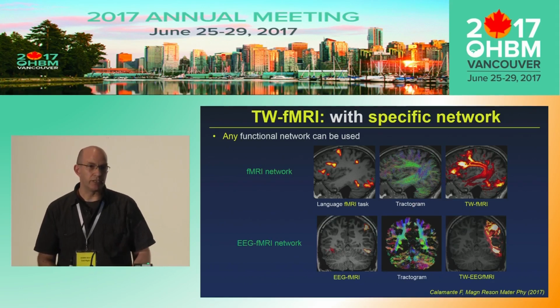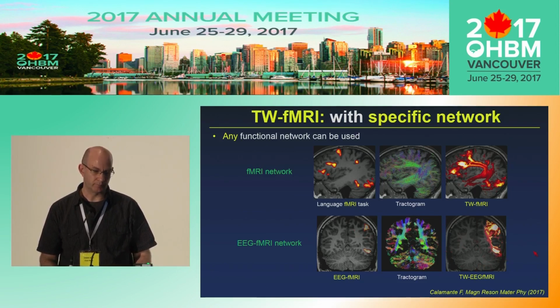This is another example. This is a patient with epilepsy with cortical dysplasia. You take EEG-fMRI, you find your network, and you use structural connectivity to relate what is the structural connectivity underlying that network. How is this network talking to each other?